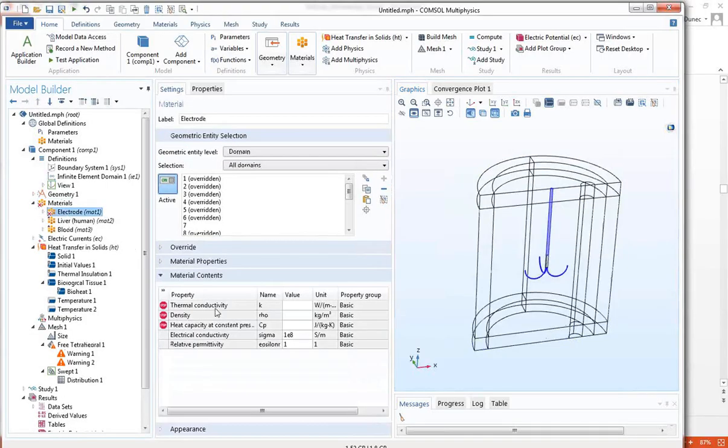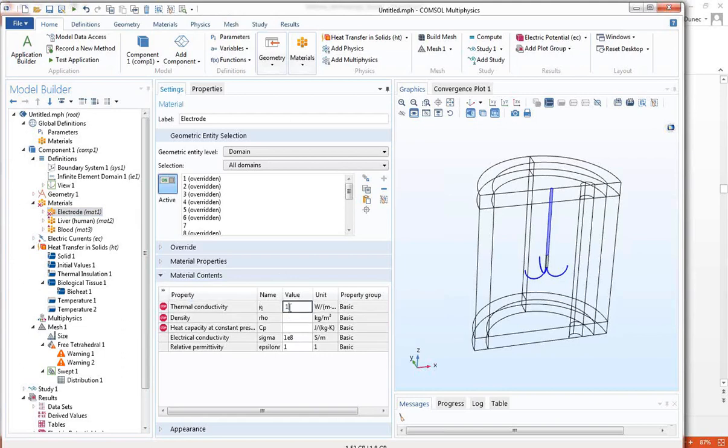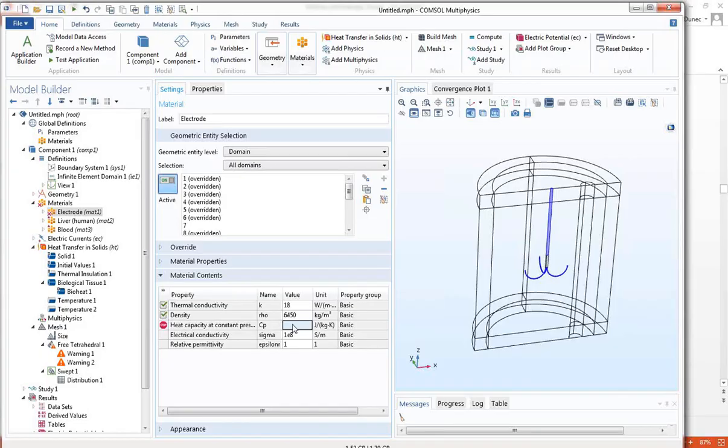Come in here, the electrode is missing a thermal conductivity. So let me add that. Looks like K is 18. Rho is, what is rho? 6450. And C sub P is 840. Okay. Okay. And I believe we are all set.